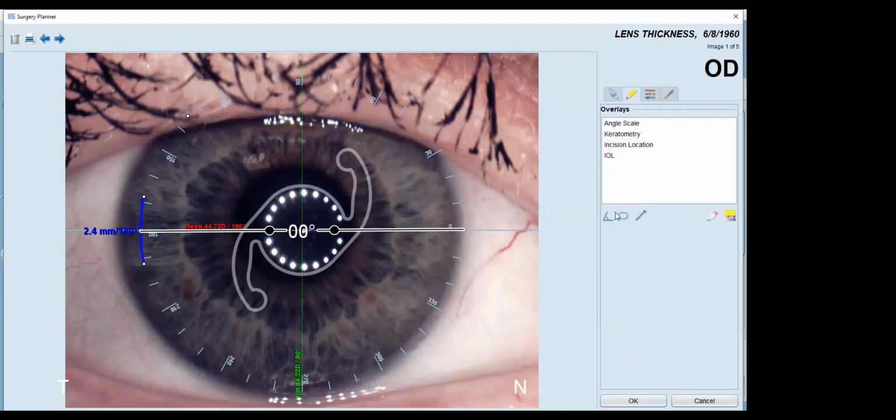A pointer, you can point something out, put a circle around something. But what I find most useful is this angle icon. So if you can find a couple landmarks to point out, you can also identify how many degrees from 0 any landmark resides. So this is kind of helpful in identifying a good position for the lens and where the center haptics might line up.